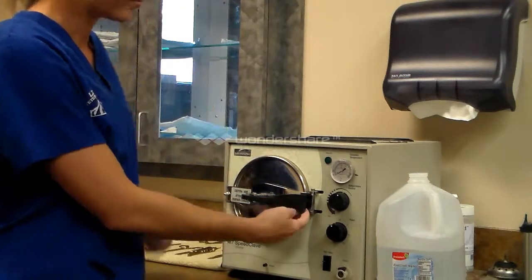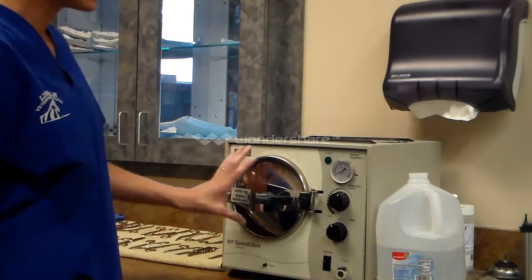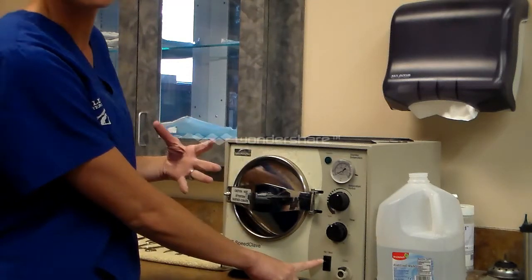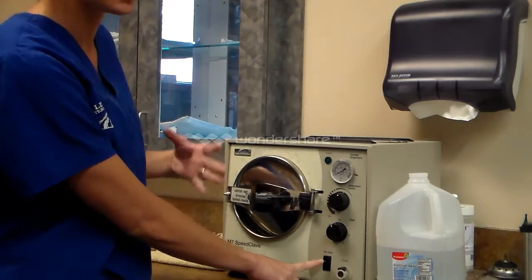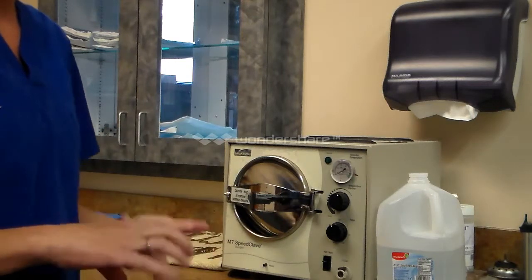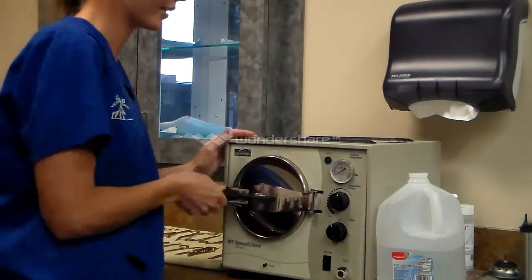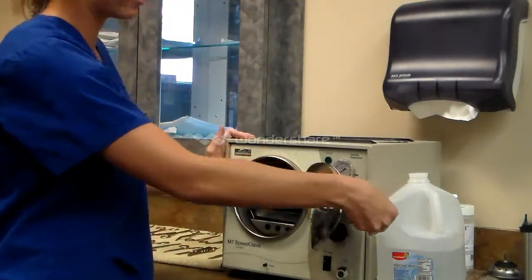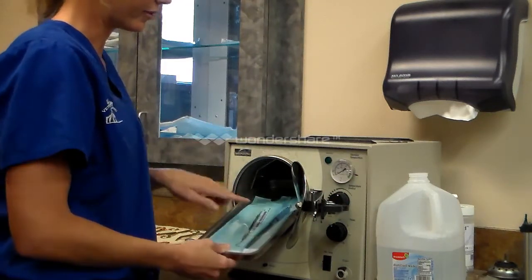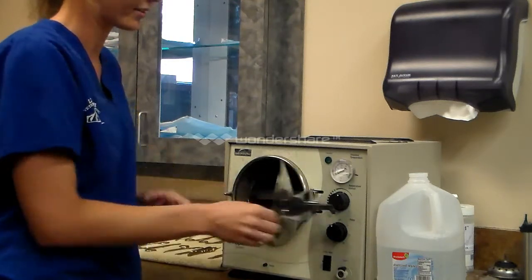So again, for the sake of time, providing that we had already sterilized these, we stop our timer. This particular model, you have to pop the door to this position. Had it had pressure in there, the door would not have vented, and we would hold this lever down to allow that steam to vent, and then we leave it in this position for at least 15 minutes, and that'll allow those packs to dry without getting any strike through from the steam. So then once they're completely sterilized and dry, we can open this up. They should be cool to the touch by then, and you can remove them. These steam indicator strips will have changed colors to let us know that they are in fact sterile.